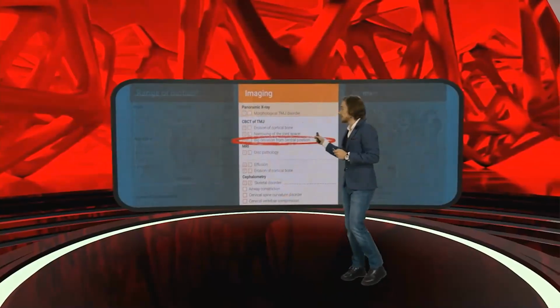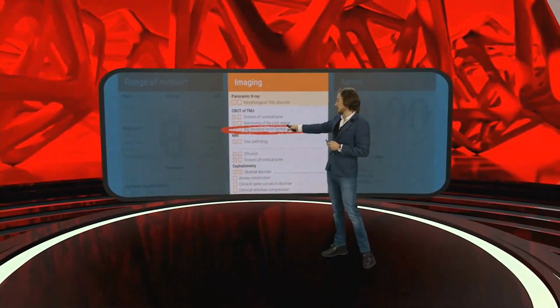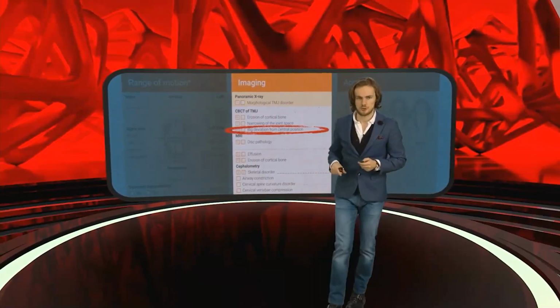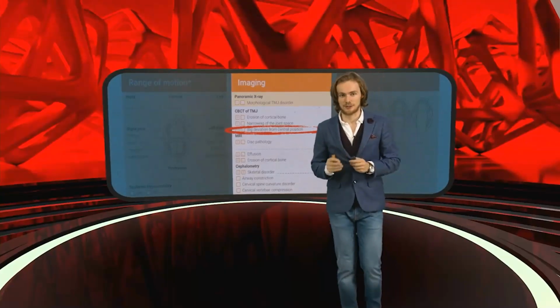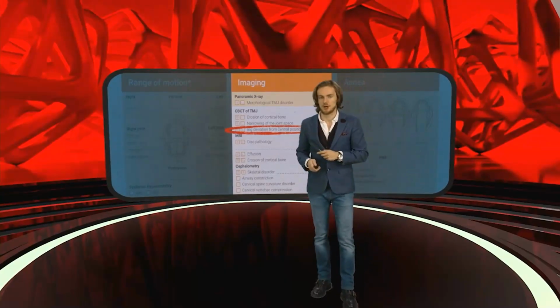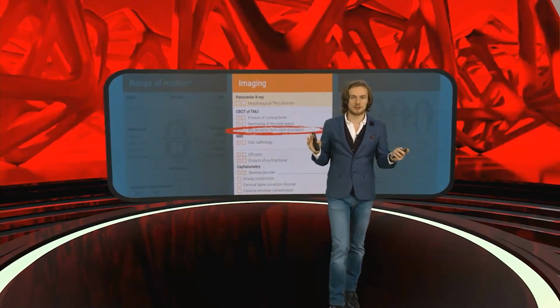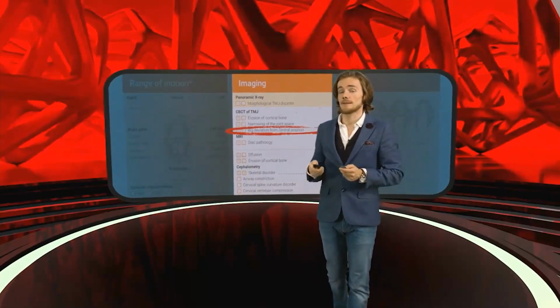So how do we mark it on our exam chart? Big deviation from the central position. This is what we choose as a partial diagnosis. This is what we see on the CBCT. So it cannot be a full diagnosis because we still need the examination and we still need the history.